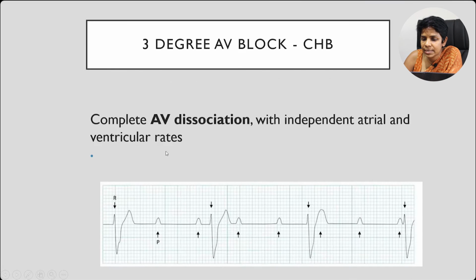So there is complete AV dissociation. P waves go on their own rhythm and rate, and QRS goes on its own rate. This is complete heart block.